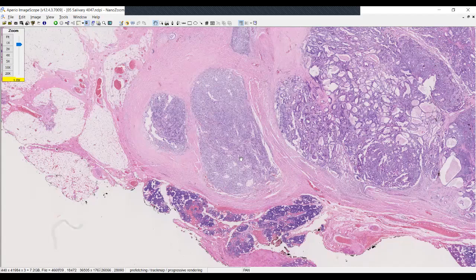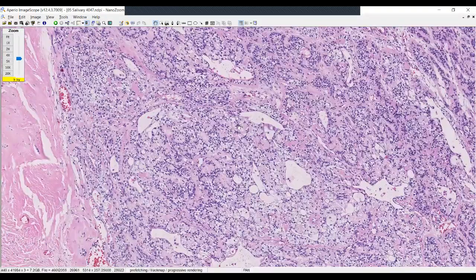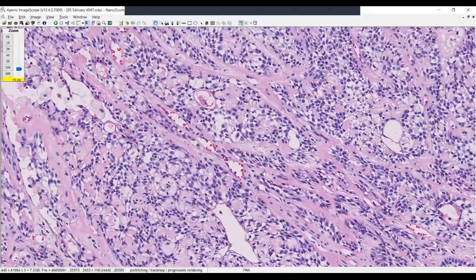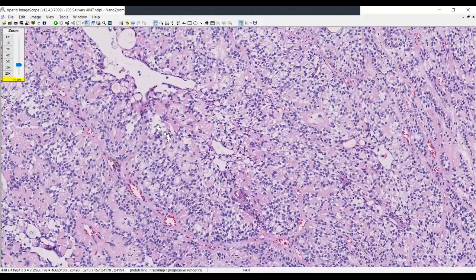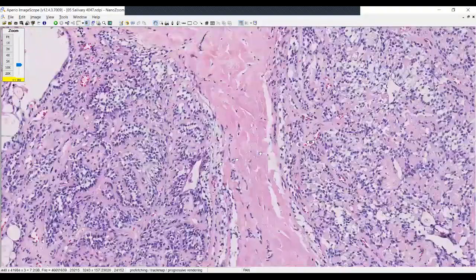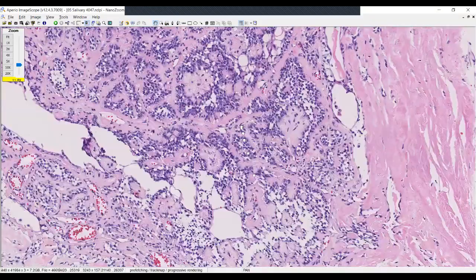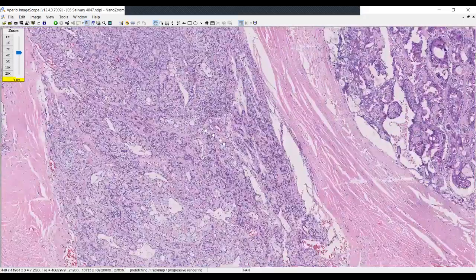So whenever I have a salivary gland tumor, there is such a lot of diversity. You really do need to think about what it is that you're going to look at. And so, as I had said in one of my other lectures, pleomorphic adenoma is always the most common thing to identify. And so, in fact, as I go into this particular space, there is a very well-developed area of pleomorphic adenoma. In my view, that is exactly what you're seeing here. There's a background hyalinization. There's an epithelial and myoepithelial proliferation. Now, granted, the amount of chondromyxoid matrix is almost non-existent in this area, and that can often be seen when you're dealing with a cellular pleomorphic adenoma.